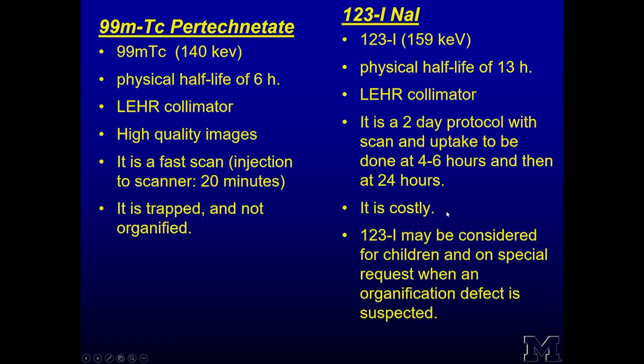It's a costly radioisotope, both from the standpoint of the price of the radioisotope itself and also due to the dual time, 2-day procedure. Therefore, iodine 123 is considered especially for children and on special request when an organification defect is suspected.